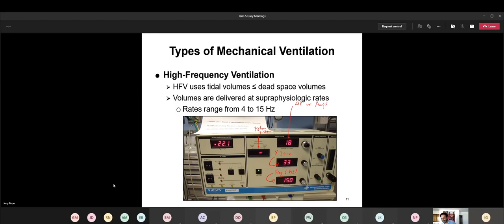And then again, if you didn't want to do it this way, you could just use this knob to adjust your bias flow. And then back over to here, here's our alarm. So not very sophisticated at all. Here's a high pressure alarm, and here is a low pressure alarm. And this is our silence. So when the machine starts alarming, here's how you silence it for a couple of minutes.